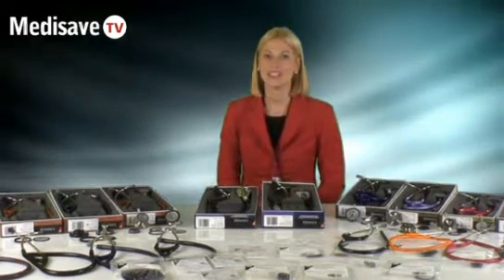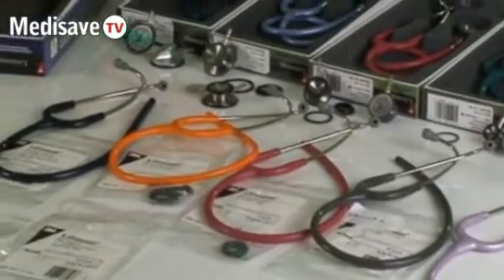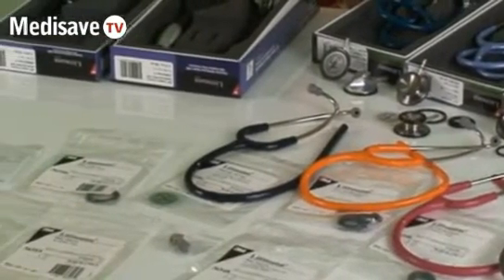Hello and welcome to Medisave TV. Today I'm going to be talking about the wide range of parts available for the Littman range of stethoscopes. Medisave holds every Littman part in stock, available for immediate dispatch.